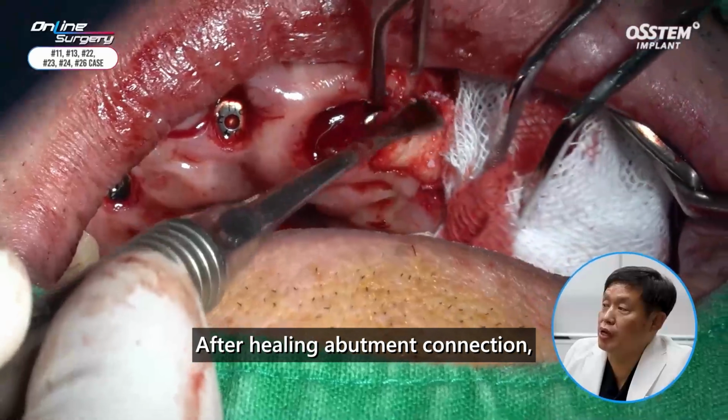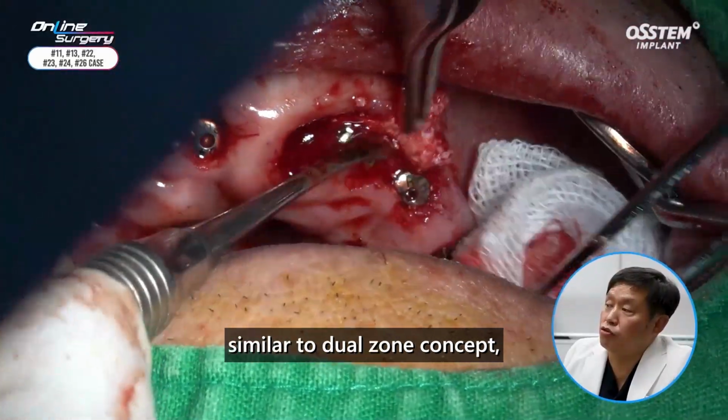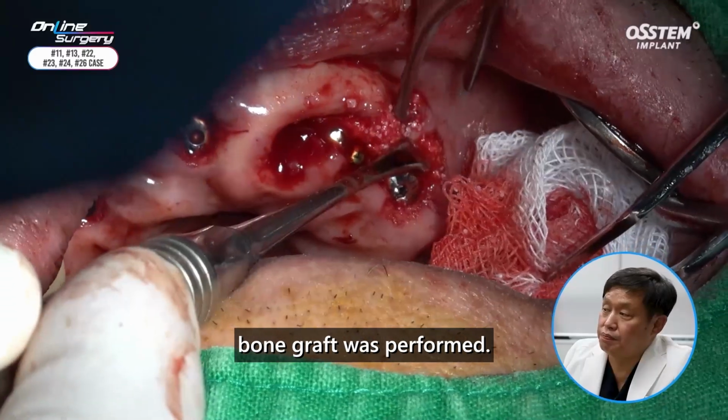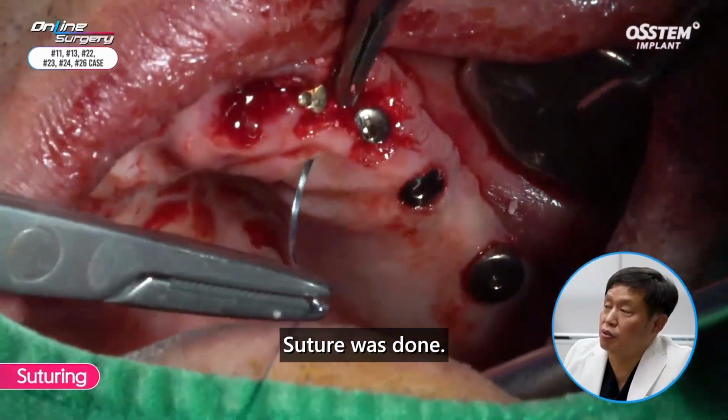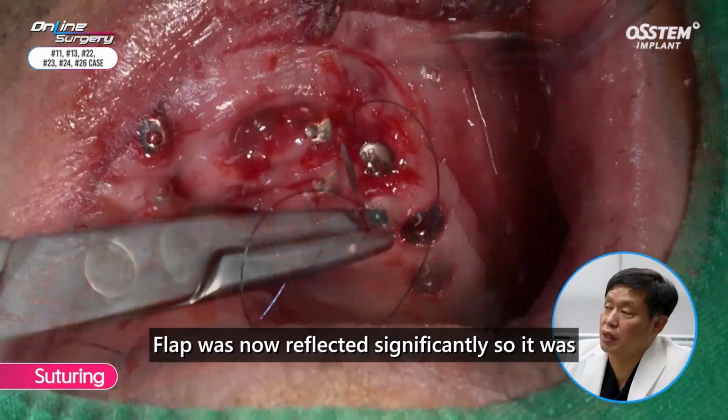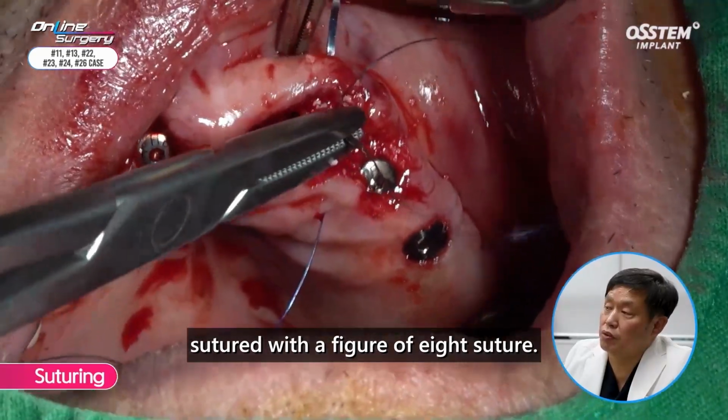After healing abutment connection, similar to dual zone concept, bone graft was performed. Suture was done. Flap was not reflected significantly, so it was sutured with a figure of 8 suture.